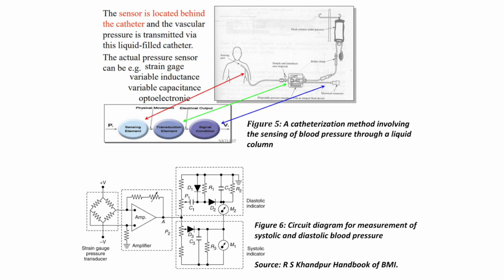The excitation for the transducer comes from an amplitude controlled bridge oscillator through an isolating transformer which provides an interconnection between the floating and grounded circuits. An additional secondary winding in the transformer is used to obtain an isolated power supply for the floating circuits.